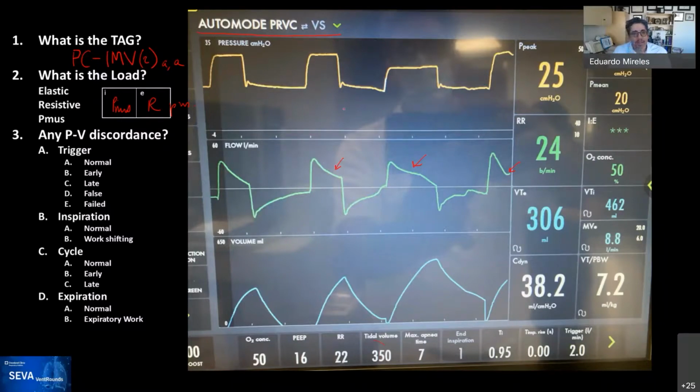Now, I'm still having challenges, and I know Amanthin is on the line, and he will throw a shoe at me, because I still have challenges on what is the actual guide from the ventilator. How does the algorithm work to suppress the mandatory breaths at what type of rate?